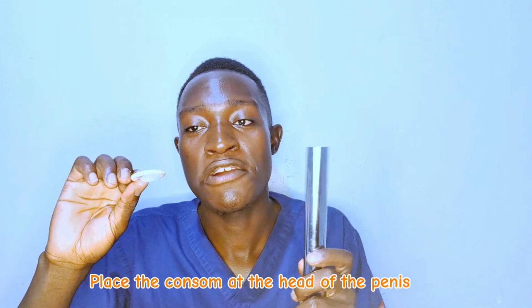So we place it at the head of our penis. This is where we said we are going to demonstrate. Like that. Have I placed it the correct way? Yes, it is the correct way.